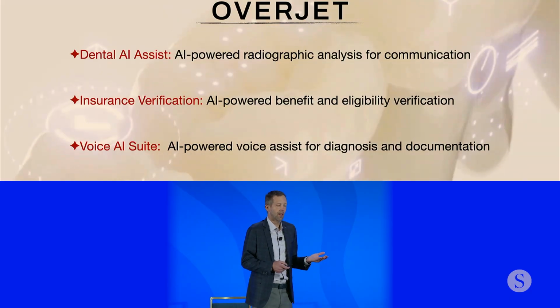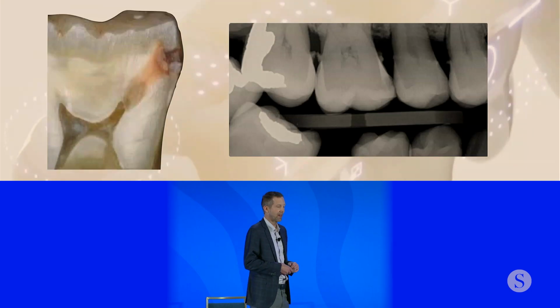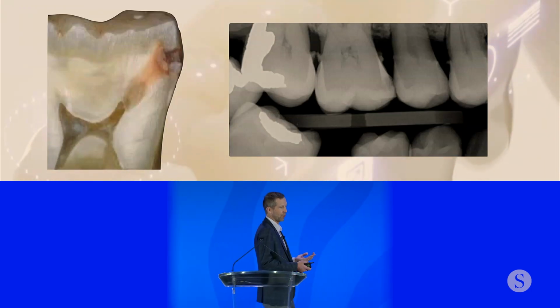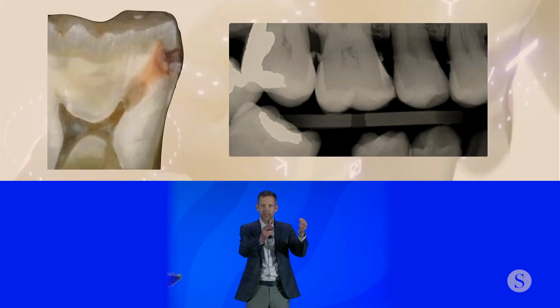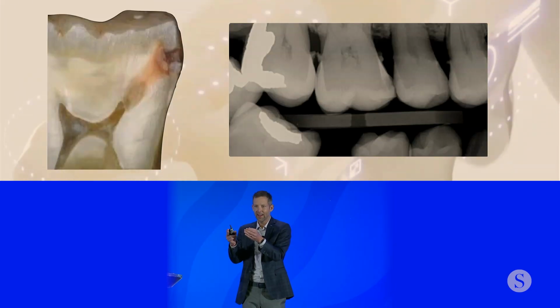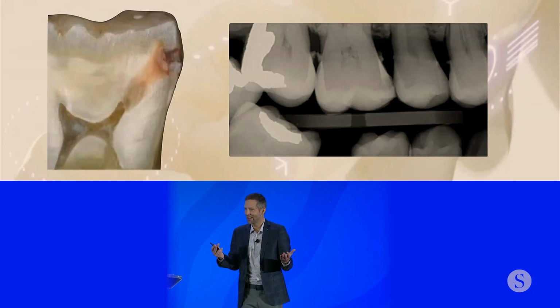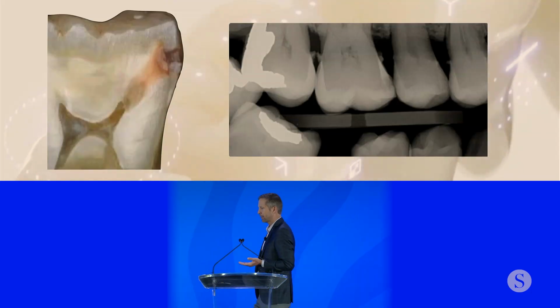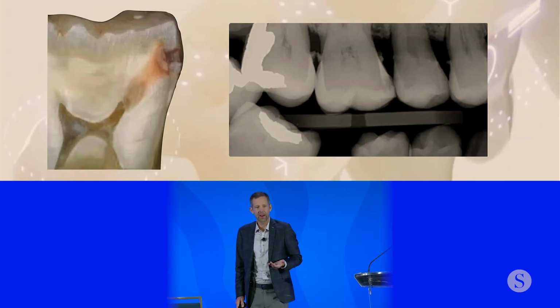Now, like I said, the concept is very, very simple. Us as dentists, we are trained to read radiographs. So for years, we've been sitting in our operatories telling patients, do you see the gray? And do you see the lighter shade of gray? Well, that other gray is a cavity, right? These are the conversations that we've had. So the purpose of radiographic AI in my mind is just to better communicate with the patient.